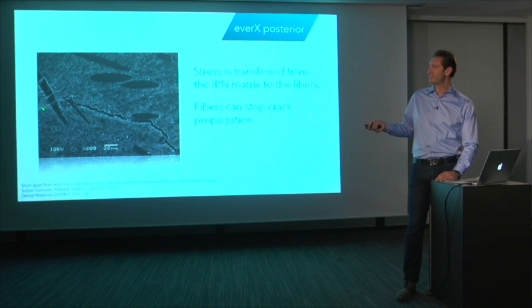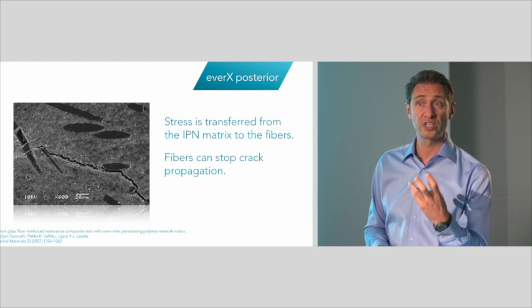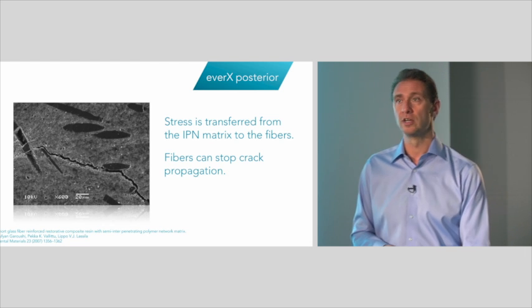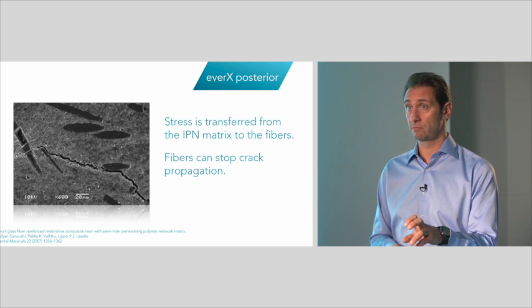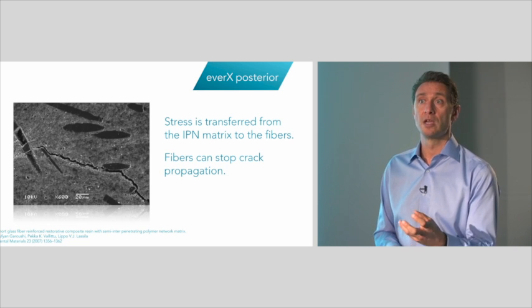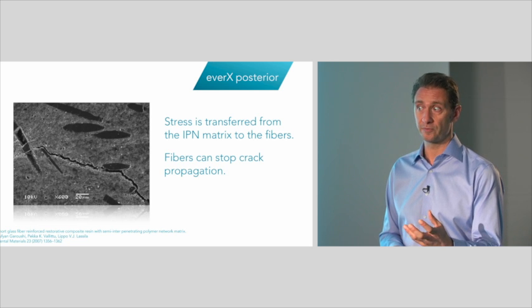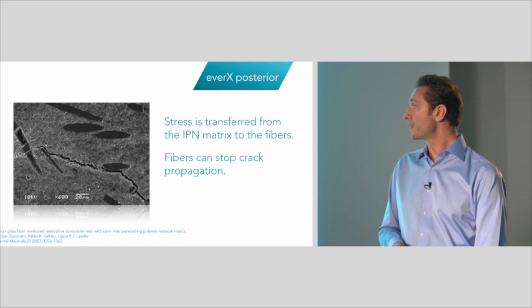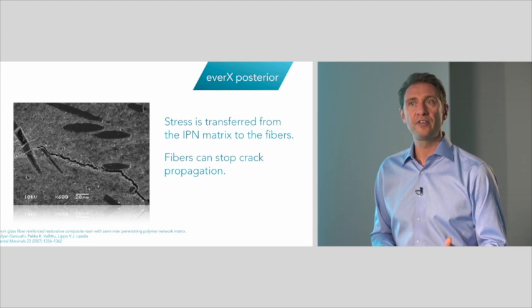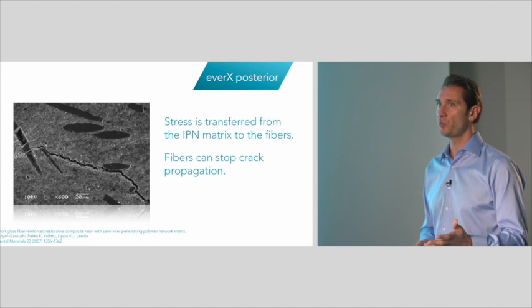So this mechanism is really working on a very microscopic scale, and it helps you really to create a material which has some amazing load-bearing capacities and amazing capacities of really resisting high forces. And it's clear to everybody that the forces in the mouth are pretty high, and those teeth, they have to work hard.